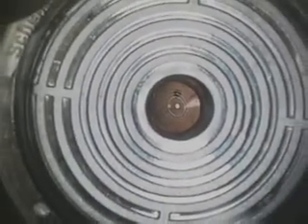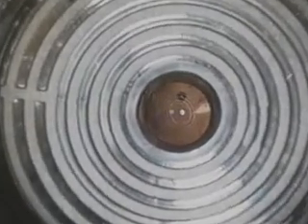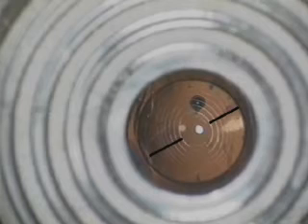The correct final positioning can be checked with a Hartmann astigmatism disc. The steepest corneal axis will be identified by the smallest distance between the projected rings. The marking on the microcyl toric should be perpendicular to the rings. Once correctly positioned, the remaining procedures are similar to standard lenses.